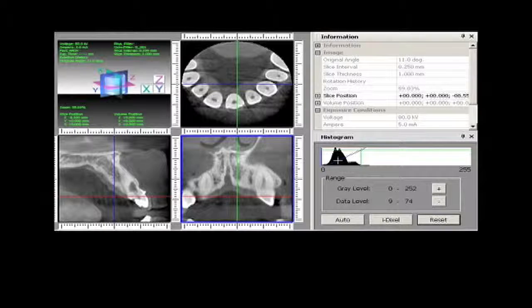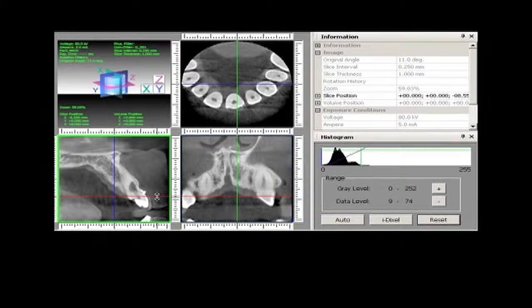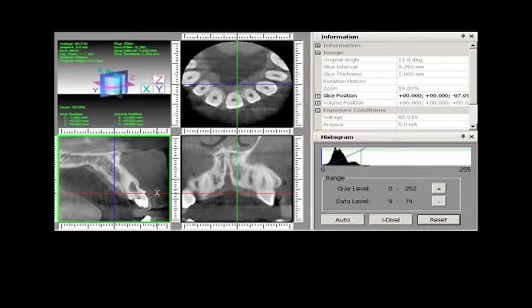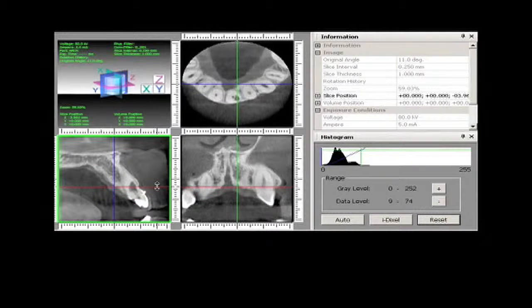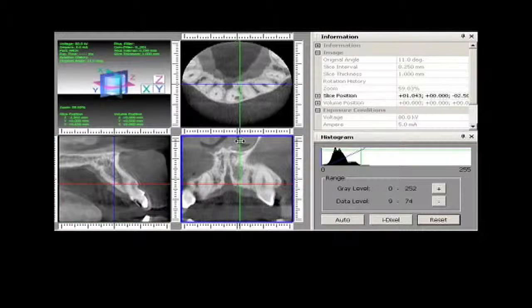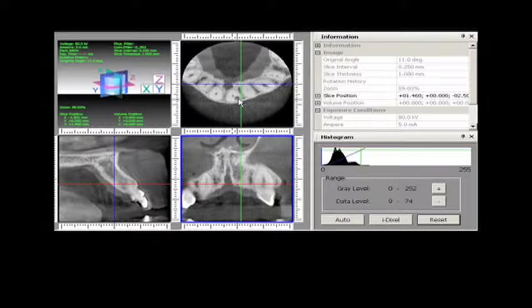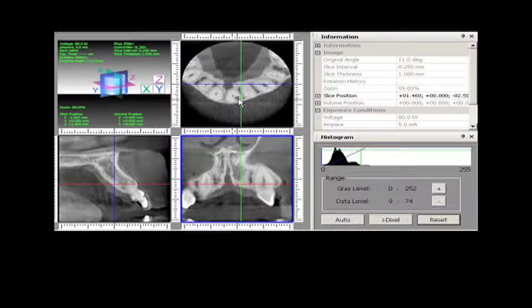We are first looking at the coronal-apical cross sections as seen in the upper right box. Moving the red horizontal bar up and down determines the level of the cross section viewed. By placing the vertical green bar next to the tooth you wish to view in the coronal-apical plane assures well-centered positioning.